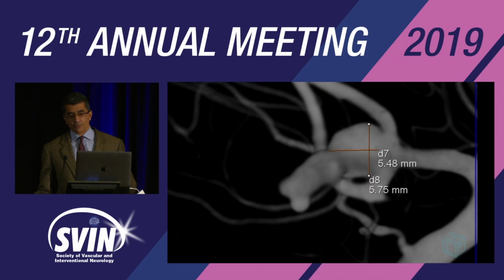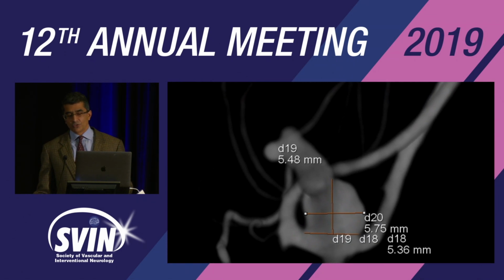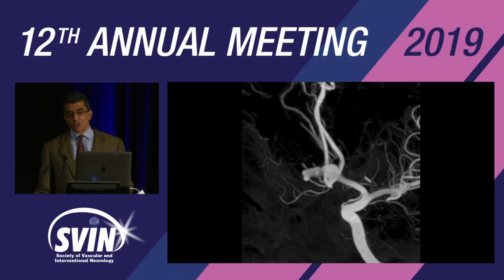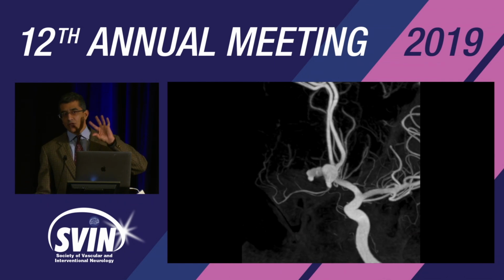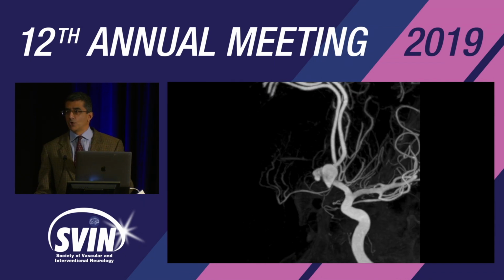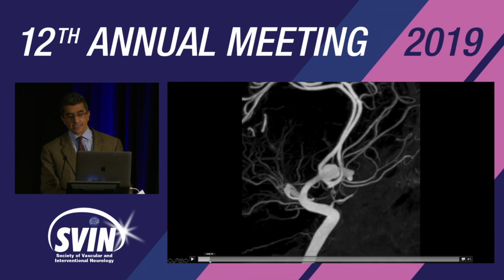But for me, the concept that has helped the most is that all we are trying to do with these measurements is to get the device situated at the neck so that the braid is perpendicular to the inflow, and what is beyond the neck is only relevant in terms of securing the neck. So we're not intending to fill the whole aneurysm with the device. We just want to position it at the neck.